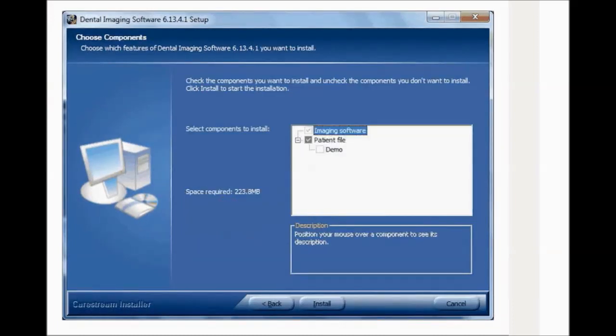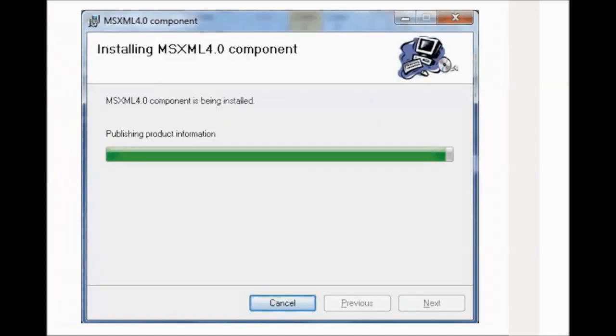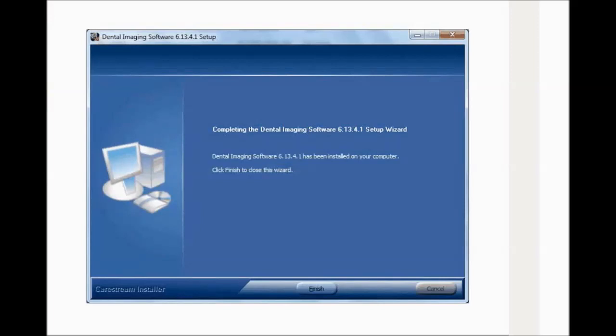When you reach the Choose Components window, you can choose to install or upgrade the following. Patient File is selected by default. You can deselect it if you do not want the patient database. Click Install to continue. The Installing Wizard window is displayed — let the installation process run automatically. The Installing MSXML 4.0 component window is displayed — let the installation process run automatically. When the installation is complete, click Next. The Installation Complete window is displayed. Click Finish. The Dental Imaging Software shortcut icon is installed on your desktop.